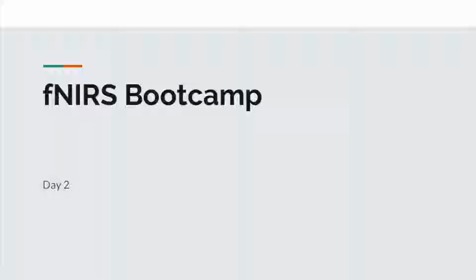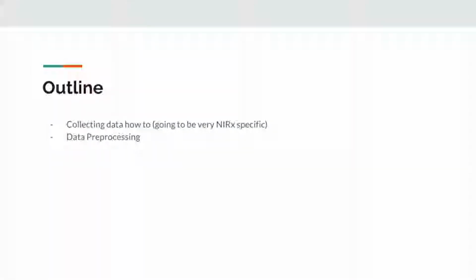Okay, so then we'll start with today's stuff. This lecture is going to be focusing mostly on the minutia of collecting data. This will be largely familiar for the people who've been collecting data so far and largely not memorable for the people who have not done data collection yet. But this will at least be a really good resource for you for when you get your first hands-on training to go back and refer to.